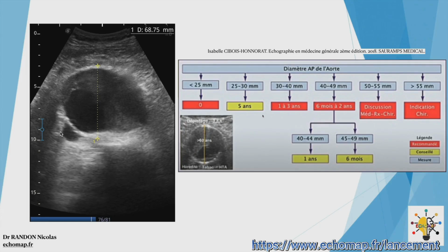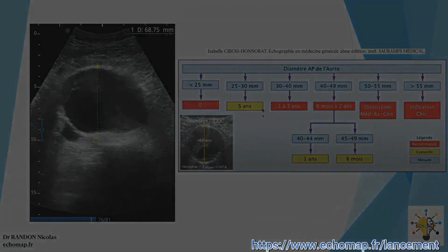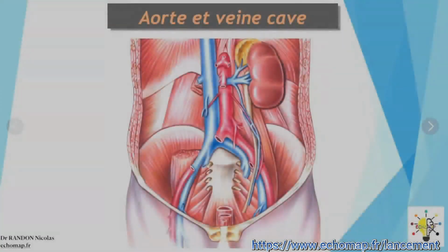Here we have, in fact, it's not a bleed. In reality, it's the inferior vena cava. So you see the size of the aneurysm, you can come across some really big stuff. So it's very codified. I was telling you, there are very precise criteria for how we locate the aorta and how we can safely measure the aorta to diagnose our abdominal aortic aneurysms.